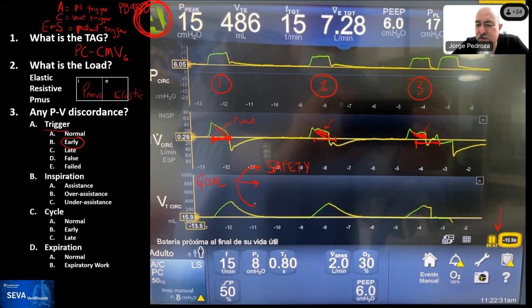So some people say sedate. Okay, and lower the respiratory rate, the mandatory respiratory rate, which in this case is 15. What else? I put it in Spanish, so FR is frecuencia respiratoria, in English, respiratory rate.